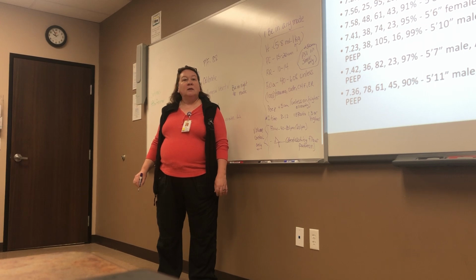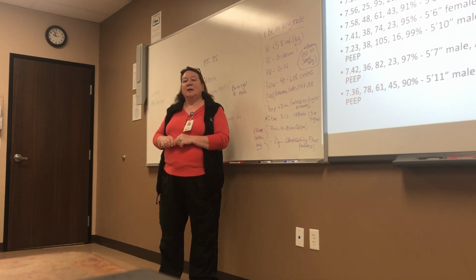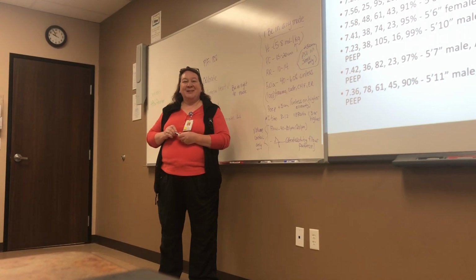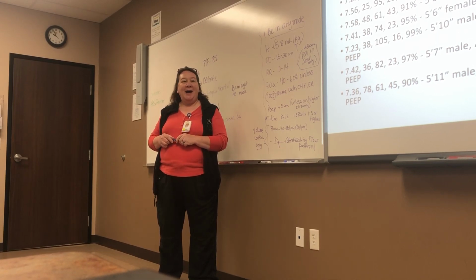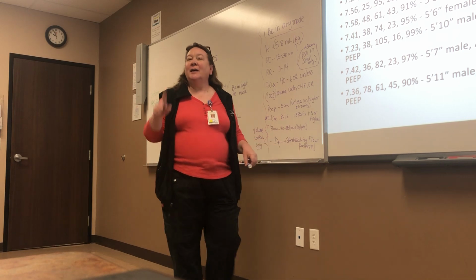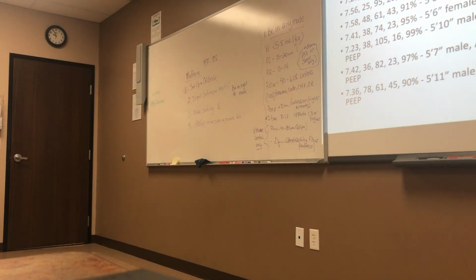Can you tell me what pressure support does? Supports pressure. Fabulous. I'm not 100% sure, but pressure support is like the baseline of pressure, correct? And then pressure control is the limit? No. Isn't it like an extra push to help overcome a tube or something? Yeah, that's pretty much it.